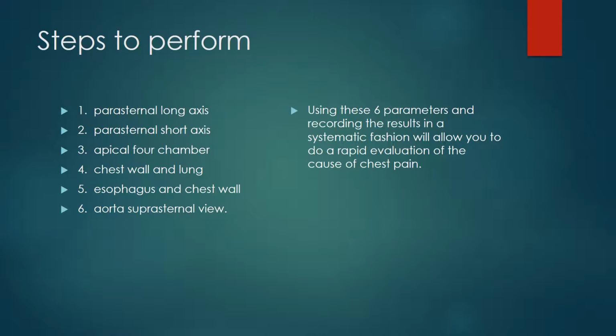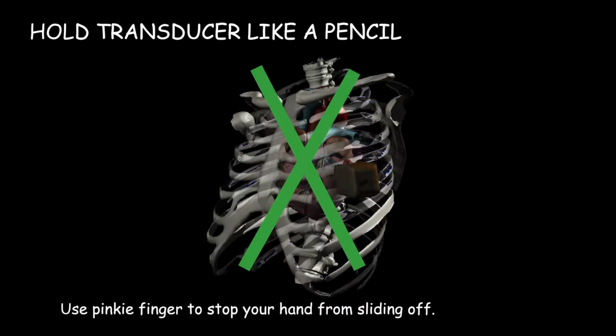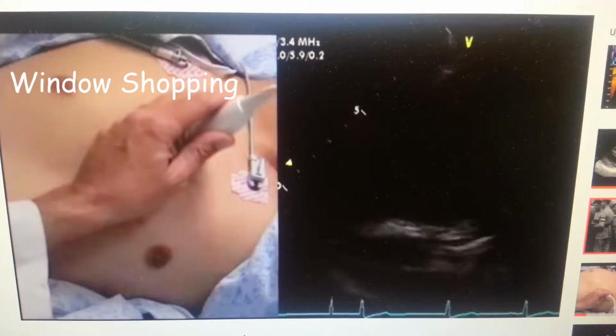The most important thing is, once you get your patient positioned on his left side and you take a view, you'll probably get that view. Don't slide down the chest wall. If you hold the transducer like a pencil and put your pinky finger out on the patient, then your hand won't slide off the patient.